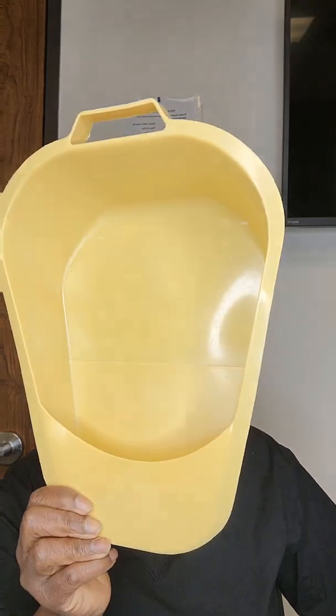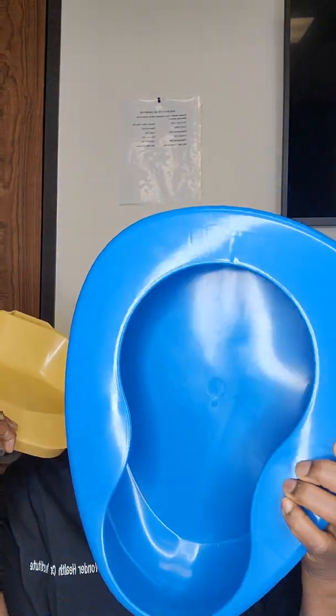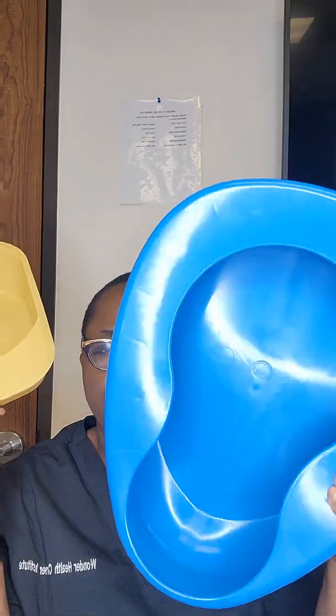Now I'm going to show you the bedpans that I have here. This one is bedpan, and this is called a fracture bedpan. This is the regular bedpan. So on your skill day, you might see these two, but please don't take this yellow one. This is fracture bedpan, and these are used for patients that had a hip fracture or those recovering from hip replacement surgery. This is the one you will use for your skill. And again, I mentioned about urinal. This is urinal, the one the male patient can use to urinate while they're in bed.